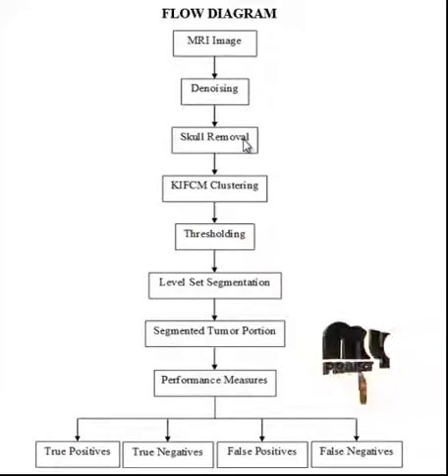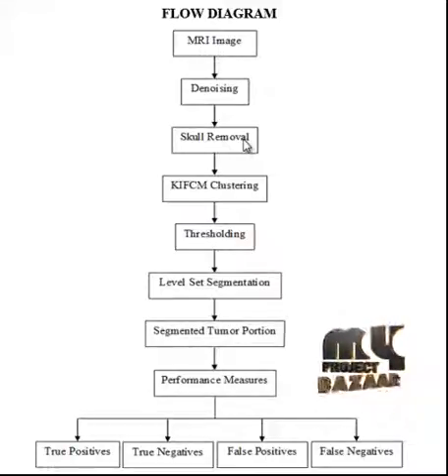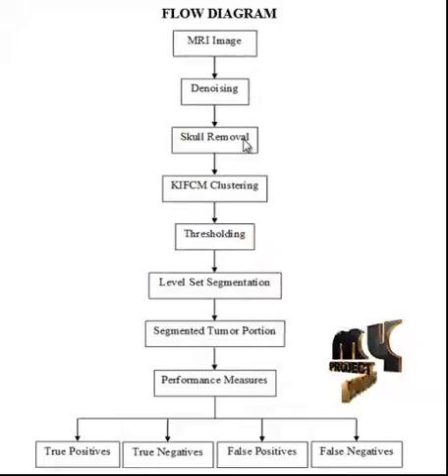The pattern of ones and zeros specifies the shape of the structuring element. The closing of the image by a structuring element is a dilation followed by erosion. The opening by a structuring element is an erosion followed by a dilation process.